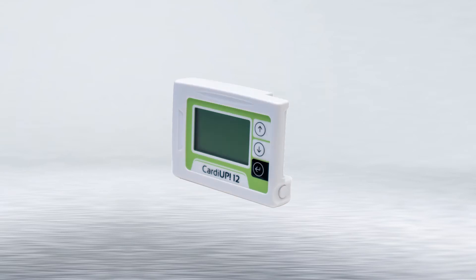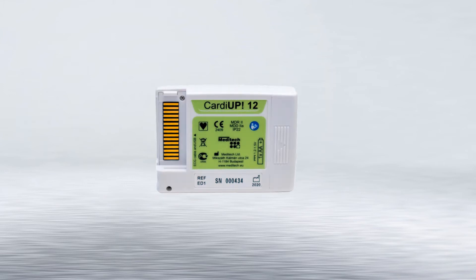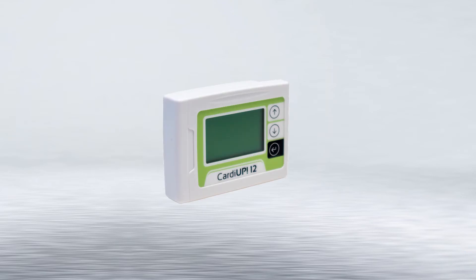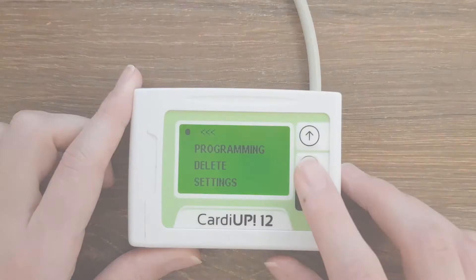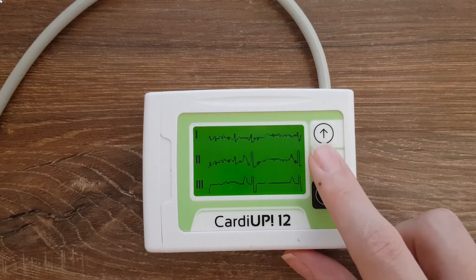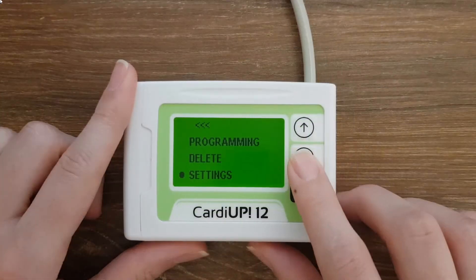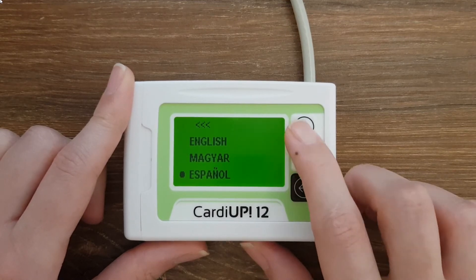Modern design for easy usage. The CardiUP! 12 Holter ECG has been designed to offer a flawless user experience in accordance with our customers' requirements. The big LCD and menu operation buttons make the device comfortable to use. This design allows manual programming, real-time on-screen ECG display for accurate hookups, easy setup of language, date and time, and various recording and other parameters.